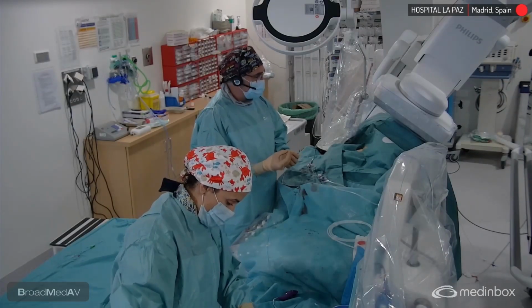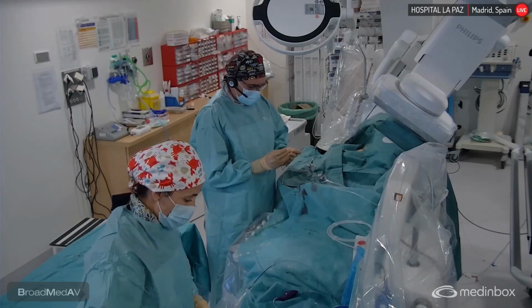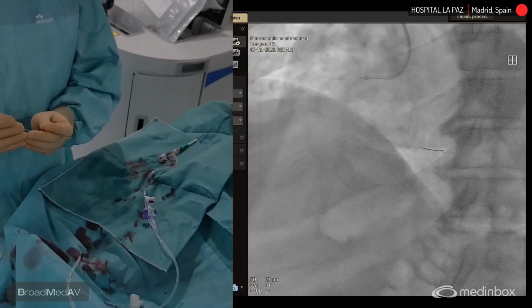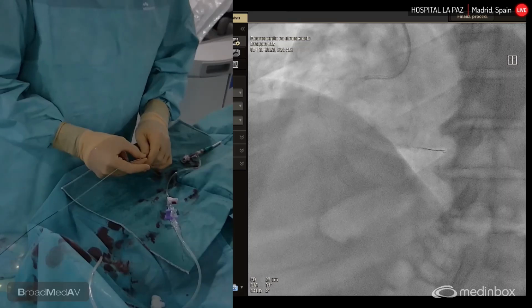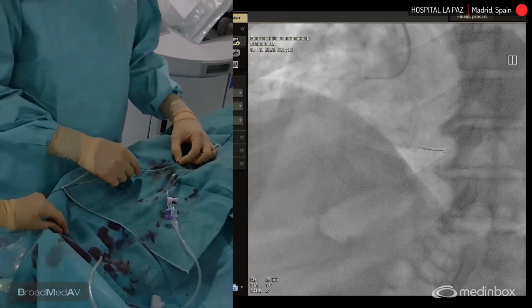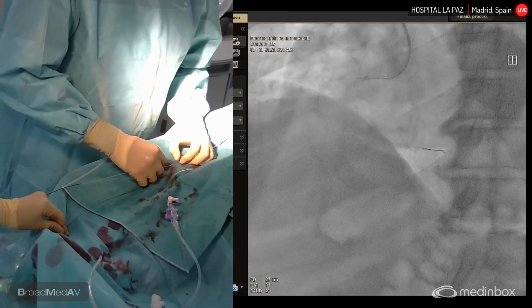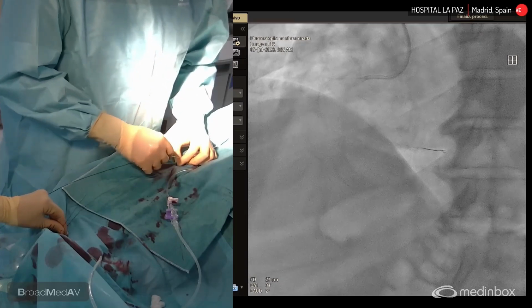Resuming the case, it is a very old restenosis, more than 15-year evolution, of a restenosis of a bare metal stent. Danny has shown the image. It is a focal restenosis in the distal right coronary artery. Our approach is radial access with an AL1 guiding catheter, 6 French.